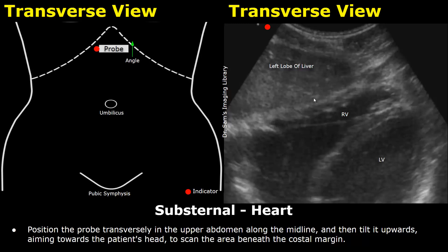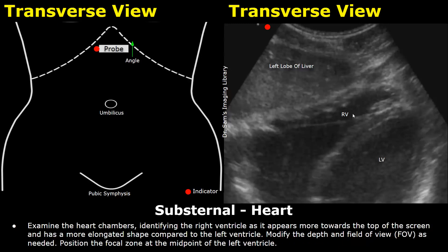The left lobe of the liver is seen as the foremost structure. The right ventricle is seen first and will appear more towards the top of the screen. It has a more elongated shape compared to the left ventricle, which will be seen below. The indicator or orientation marker is towards the patient's right side.